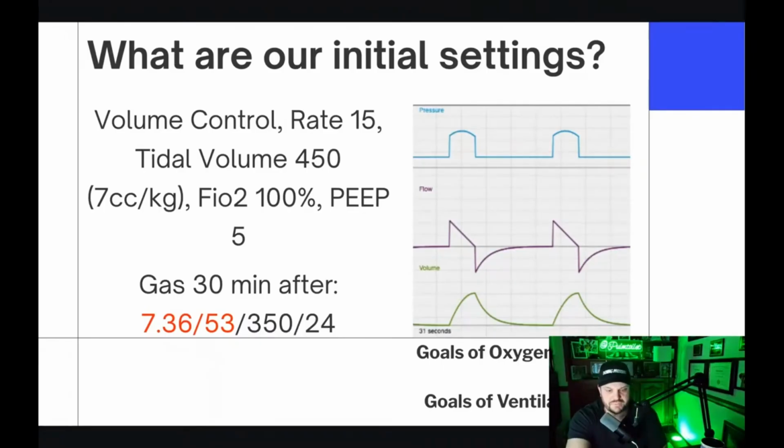Comment from IG: should people be ashamed for using 7.5 of PEEP? Yes, we should always shame people for using half of PEEP. No, I'm kidding. You can use whatever PEEP your heart desires. Some people get really upset when you use odd numbers, like PEEP only exists in 5, 8, 10, or 12. If you put the PEEP on 7 or 9, people freak out, which I think is funny. But this gets to a larger meta point, which is I want the patients to trigger all their breaths.